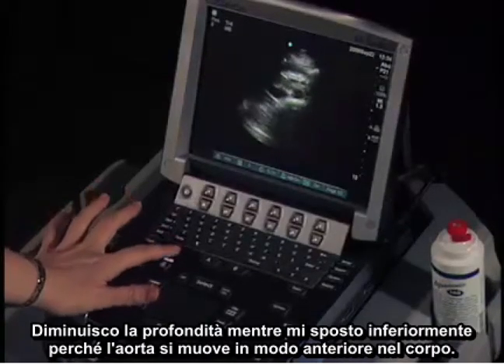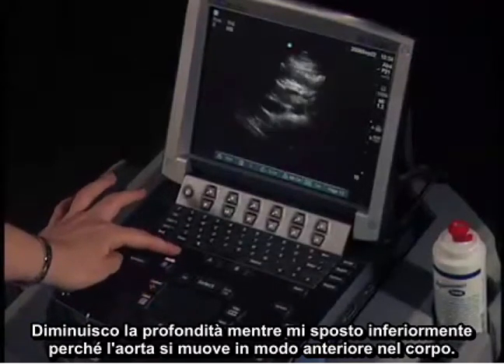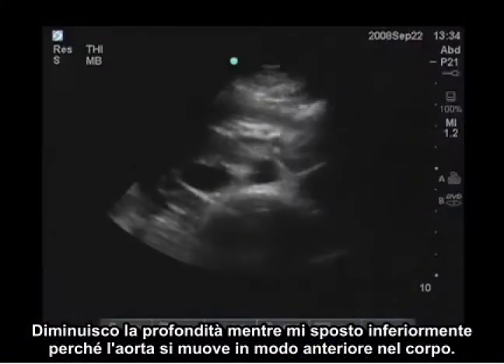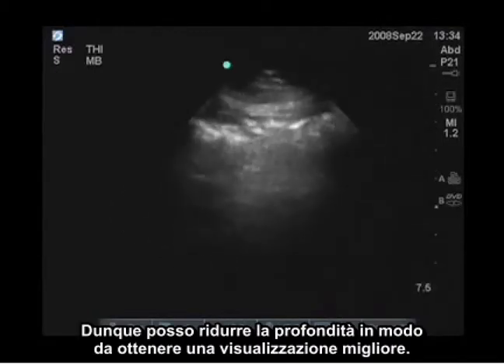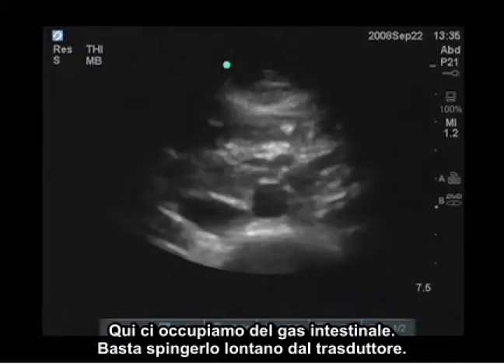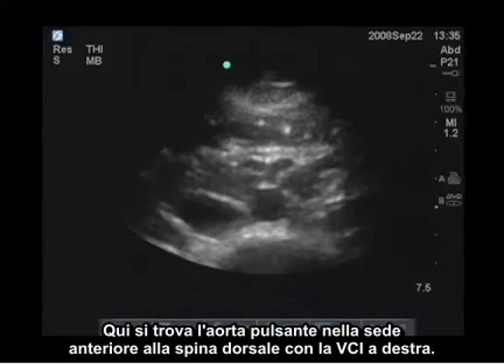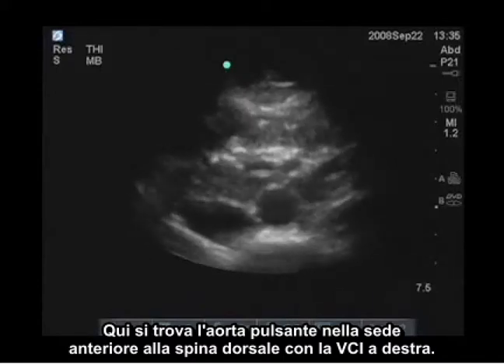And I'm going to decrease my depth as I move inferior, because the aorta is going to move anterior in the body. So I can decrease my depth to get it into better view. Again, we're dealing with some bowel gas here. I just push it away with the transducer, and here's the aorta pulsating, just sitting anterior to the spine with the IVC to the right.